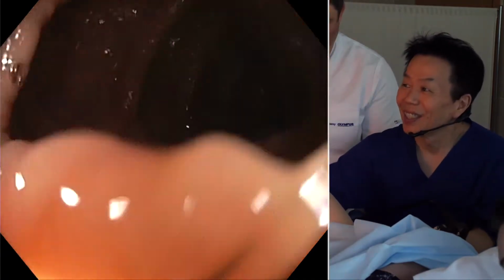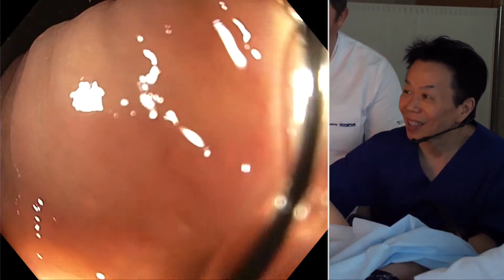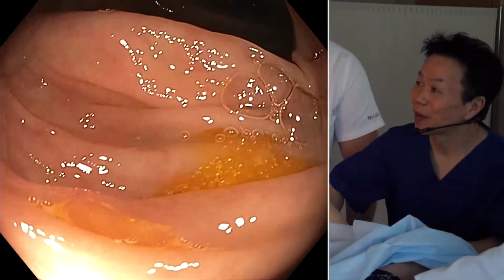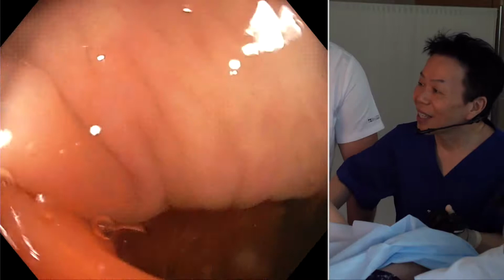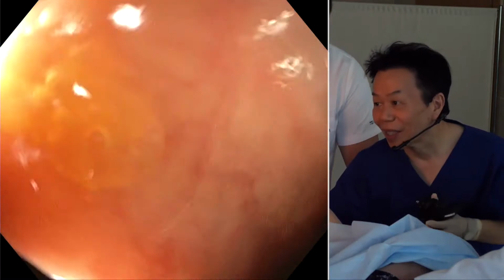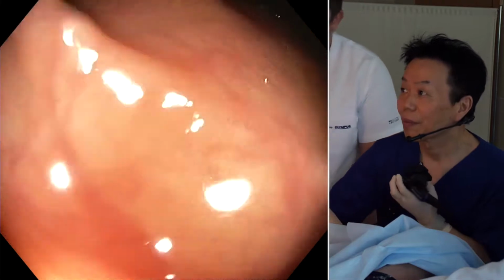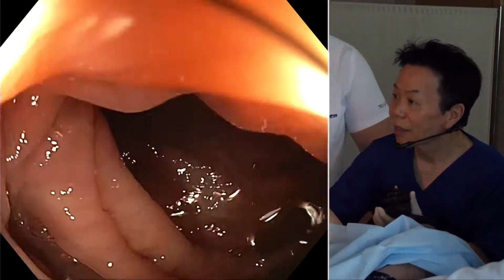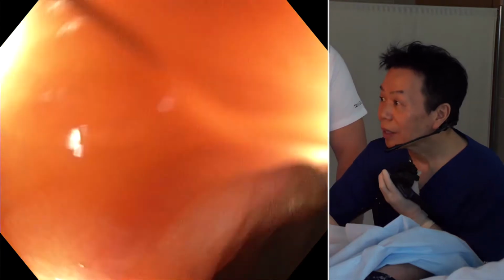As I said before, the position of the trolley is not very good for me, and the scope is too long. Again, there is some paradoxical movement. When I push, I cannot proceed. So maybe the colon is a little bit elongated. I try to straighten and shorten it as much as possible. Suck the air, and yeah, it's 80 centimeters from the anus.